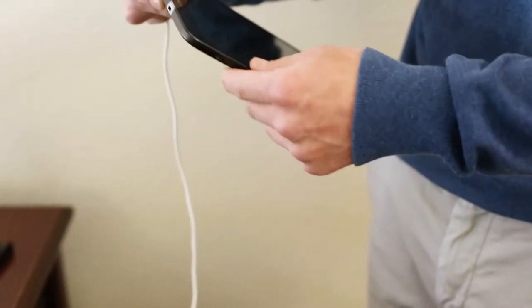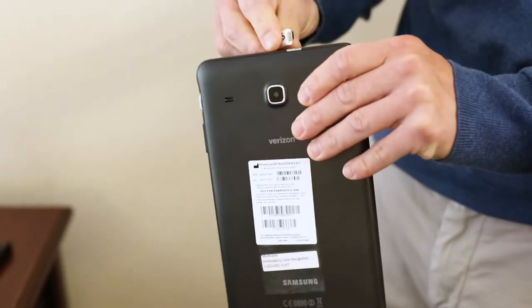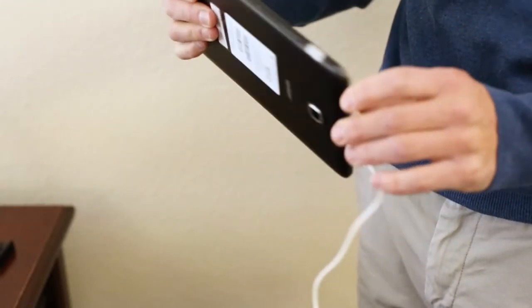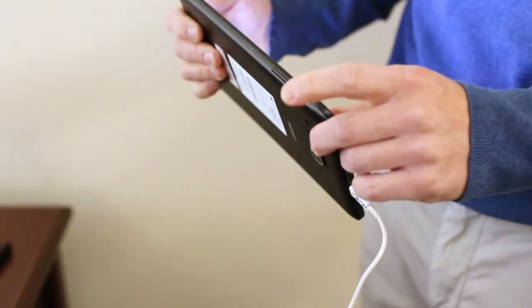The tablet monitor needs to remain plugged in at all times. Identify the highlighted silver spot on the short side of the monitor. Make sure the power cord is attached to this port on the monitor and then plugged into the wall.